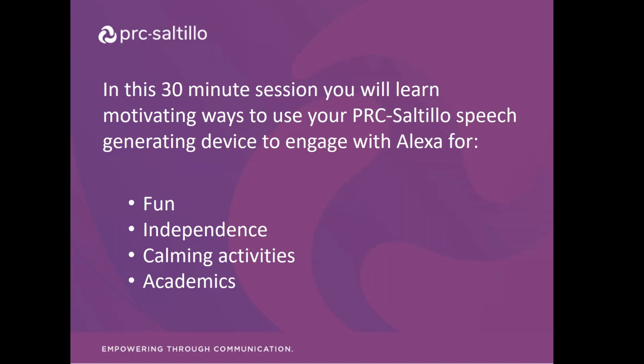In these quick 27 minutes we have, we're going to learn some ideas for how you could use your PRC-Saltillo devices with Alexa for fun, because there's lots of silly and engaging things you can do with Alexa. Also maybe for independence with certain tasks. Also, lots of calming activities as well.